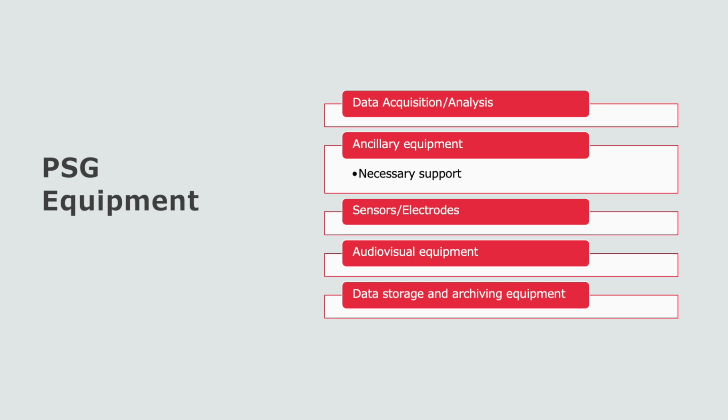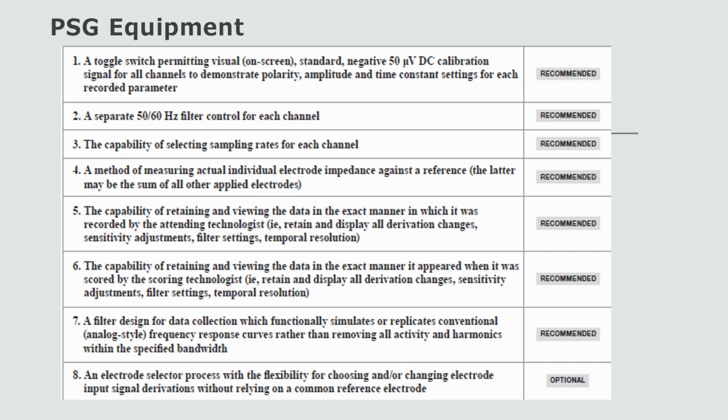There also needs to be a way for these sleep studies digitally to be stored. Depending on what kind of sleep software you have, you will need additional computer storage or a third-party company to hold your data. These studies could be anywhere from 2 to 5 gigabytes of data, so everything is going to fill up really quickly as far as your storage.